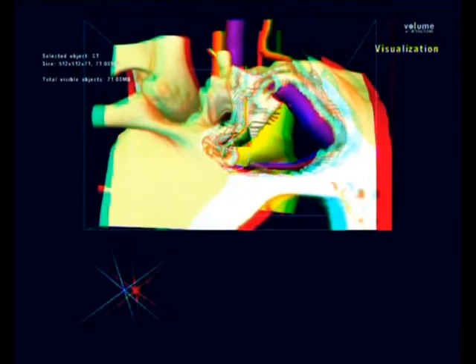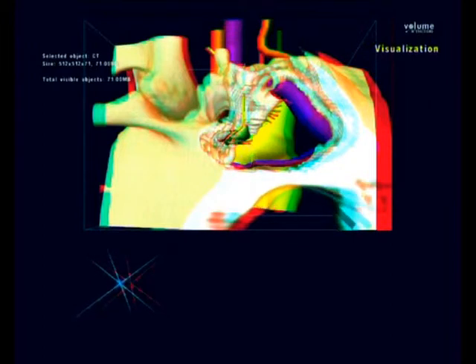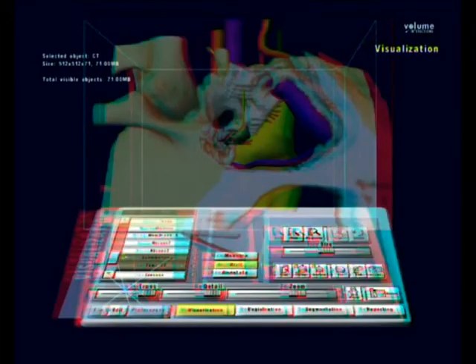The canals are now removed, and the drilling is taken anteriorly in a translabyrinthine type approach. Here you can see the facial and the vestibulocochlear nerves exposed in the internal acoustic meatus. The ossicles are now defined, as is the tympanic membrane. The ossicles are now removed. The tympanic membrane removed.